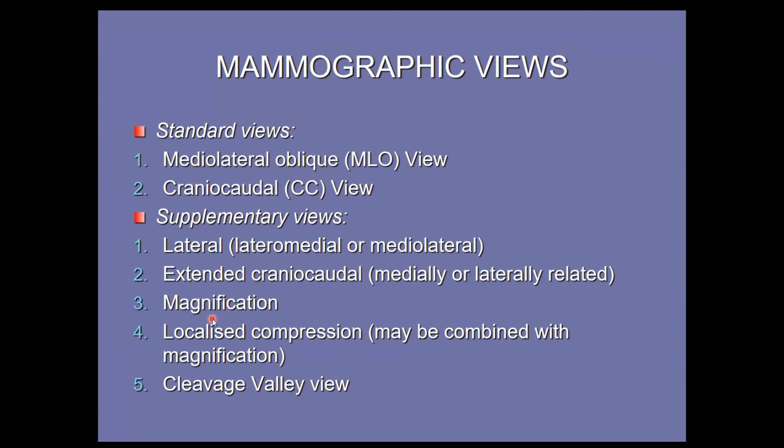Magnification. If we move the X-ray film away from the subject, then we can magnify the image. This magnification is done to see microcalcifications, very small specks of calcification in the mass. We use this method. Localized compression may be combined with magnification. Instead of giving compression to the whole breast, we can compress a specific area where we are suspecting a mass.